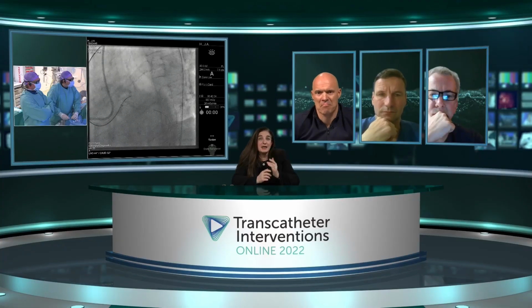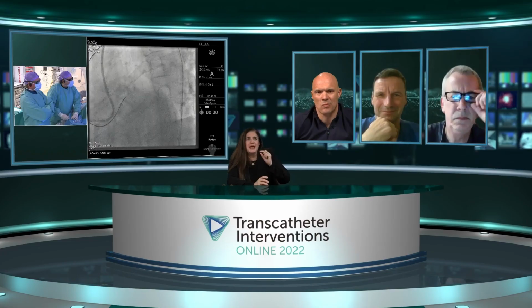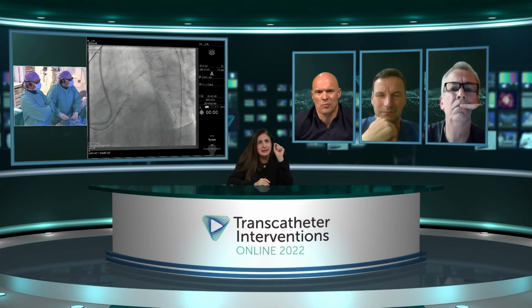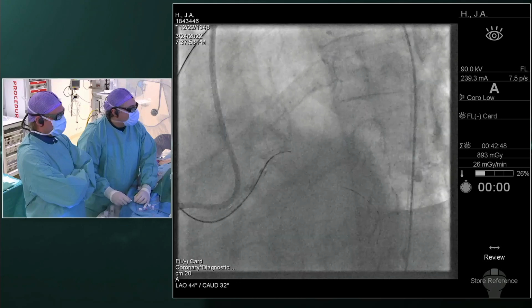Well, I think it makes a lot of sense what you're doing. I was just wondering, were you able to get any kind of imaging at all? It doesn't seem like it, right? No, because it's so calcified that nothing was crossing there.